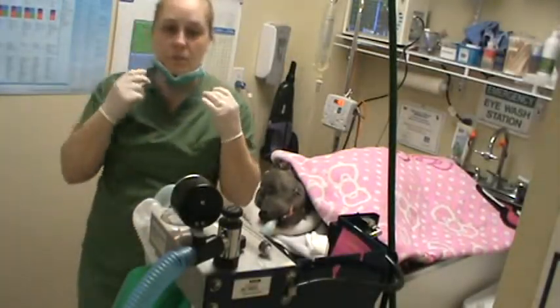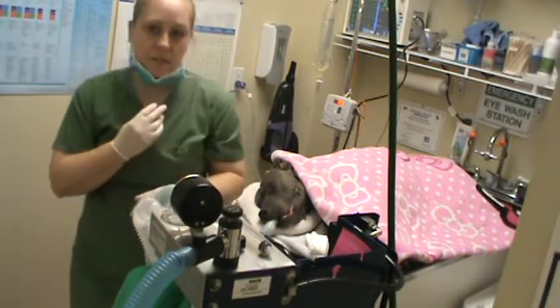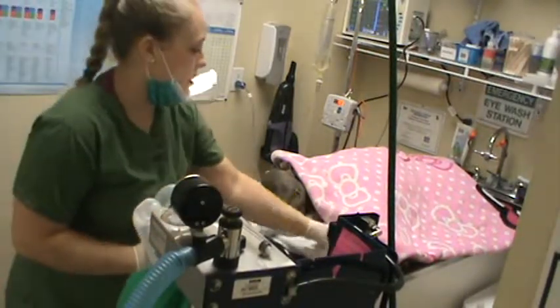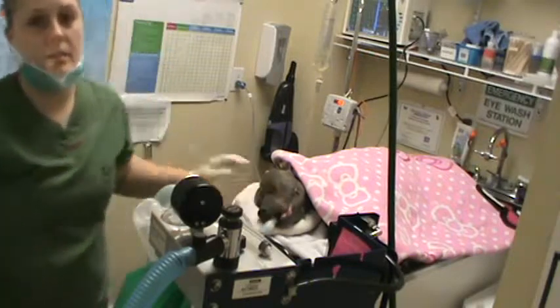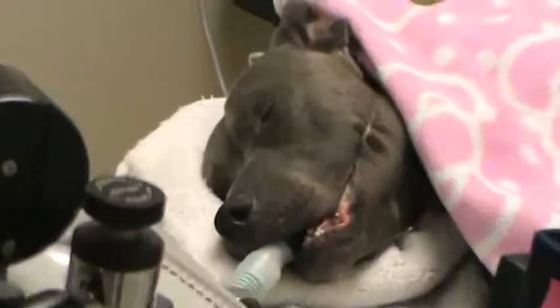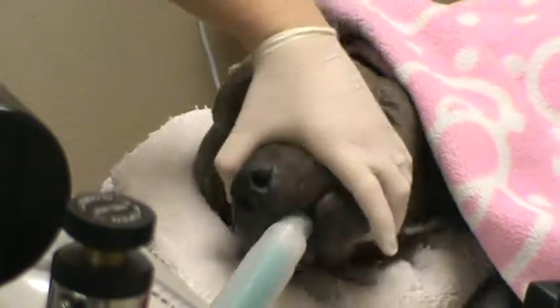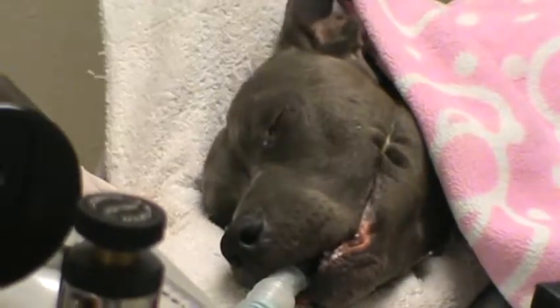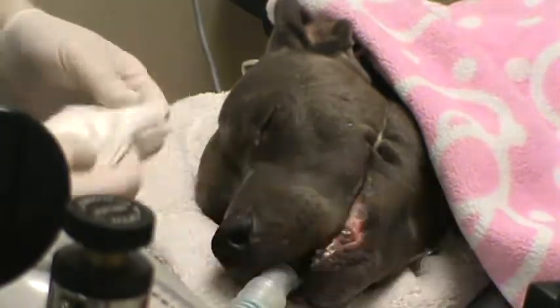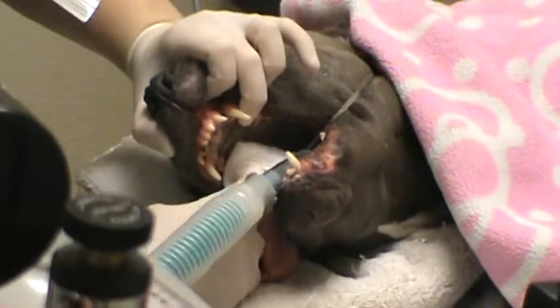This is Chelsea Marks for the ETT 220 test number 50, and that is a dental prophylaxis we're going to be doing on this dog here. First thing I'm going to show you is we have our patient intubated properly and the cuff is inflated, which is important so the water doesn't go down into the back of her throat. We also are going to use these little sponges to put in the back of her throat so that water doesn't go down the back.